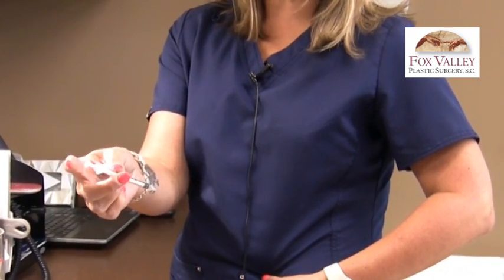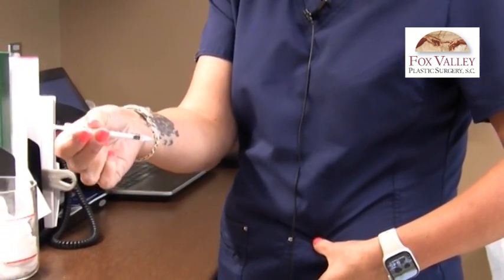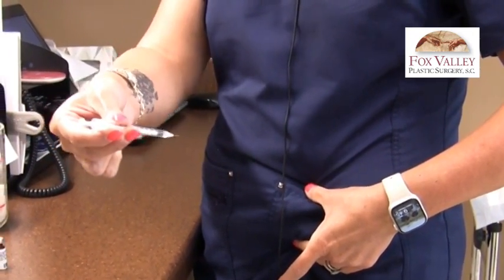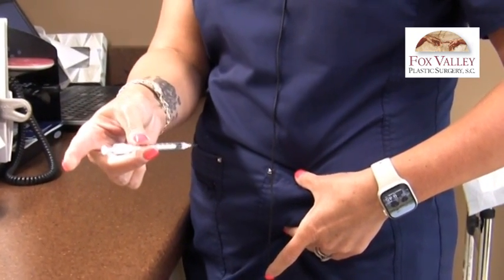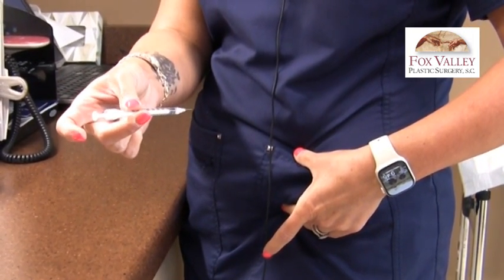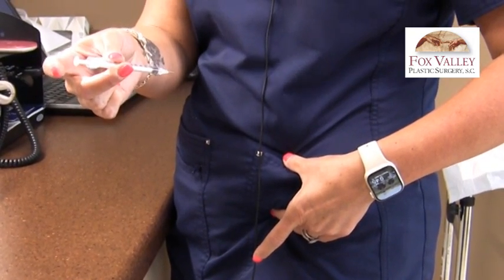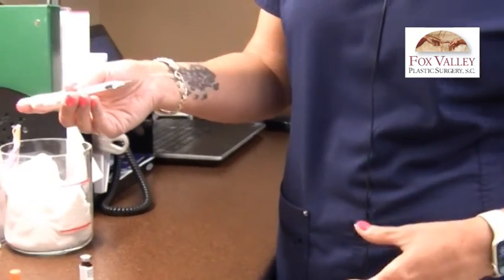Pinch the fat in that area while holding the syringe. Don't put your finger on the plunger as you're inserting — wait until the needle is fully buried into the skin before administering the injection. Go straight in to your abdominal tissue, and once it's all the way in, take your finger and slowly plunge it down. You can leave the needle in your skin for a few seconds, count to three if you want, then withdraw the needle.